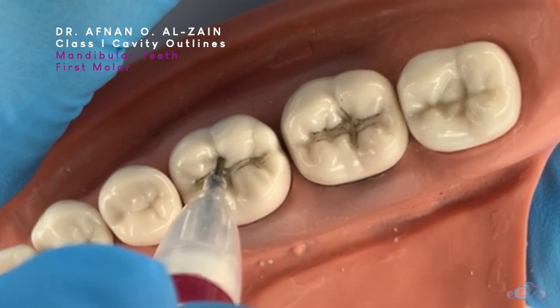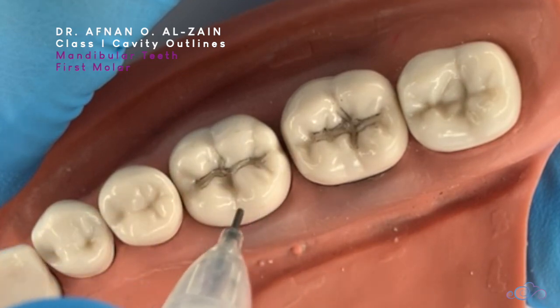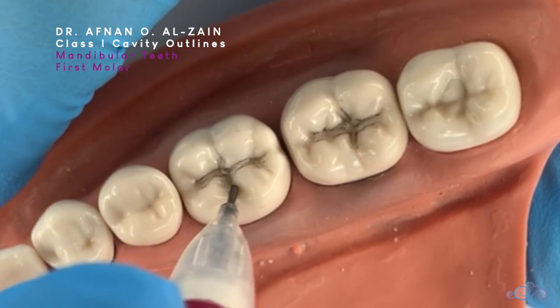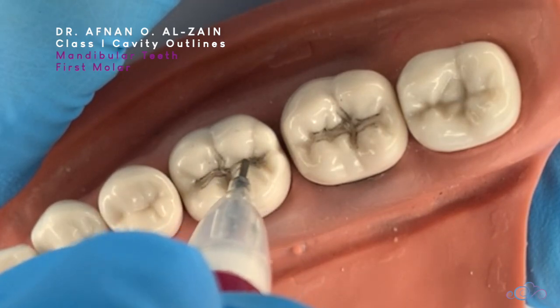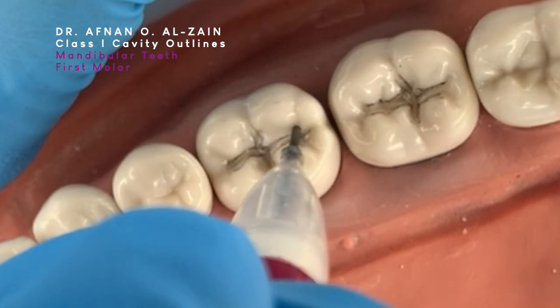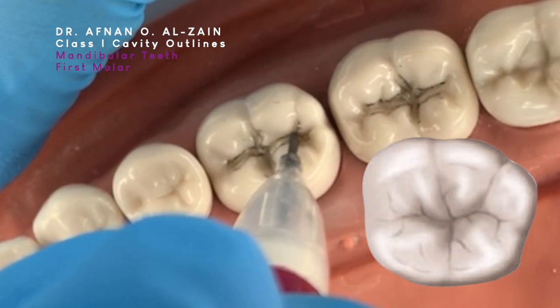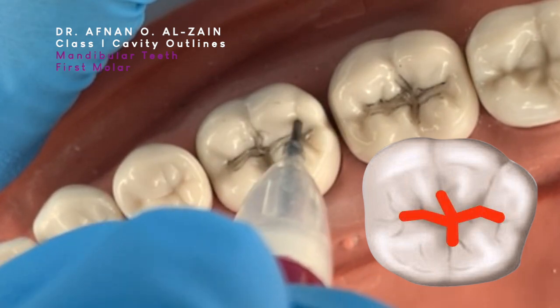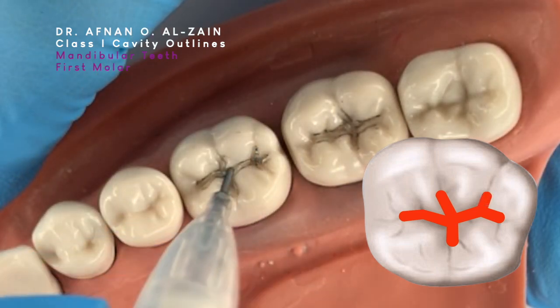After that, we're going to extend buccally halfway. You don't want to overextend so you don't weaken the cusps — halfway buccally and then halfway lingually. After that, we don't forget the distal groove because we have the distal cusp here. It's going to be small, but it's going to be there. So this is the outline of tooth number six.